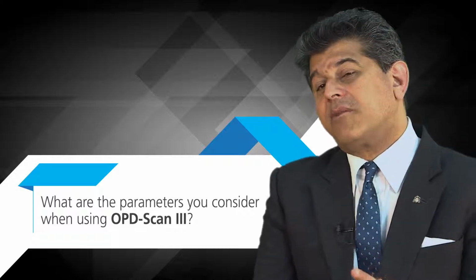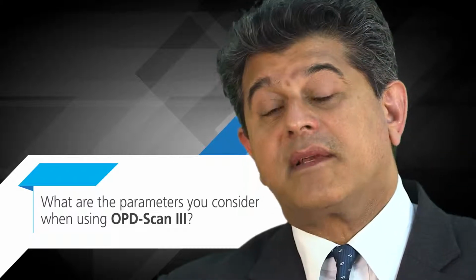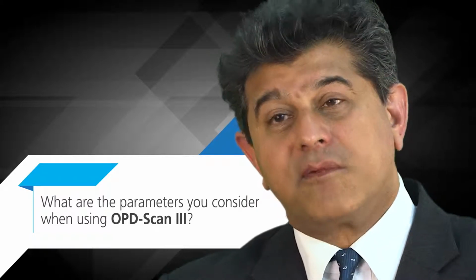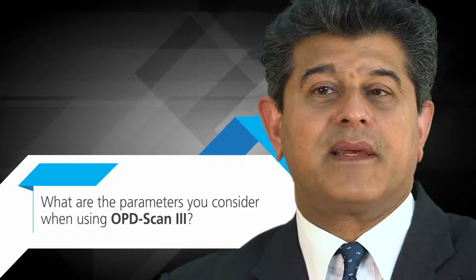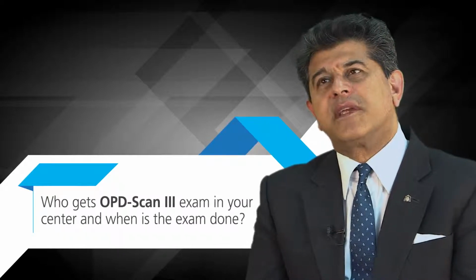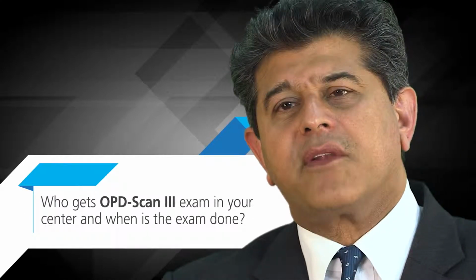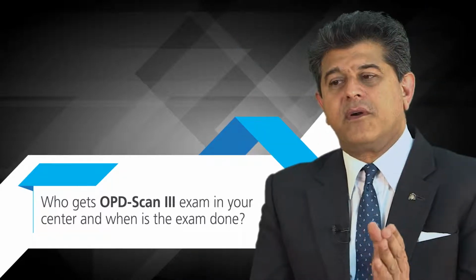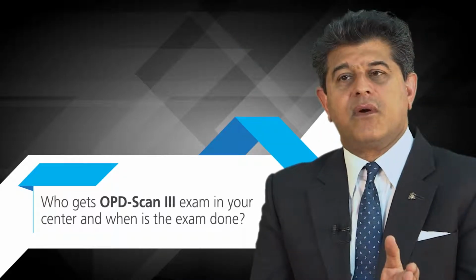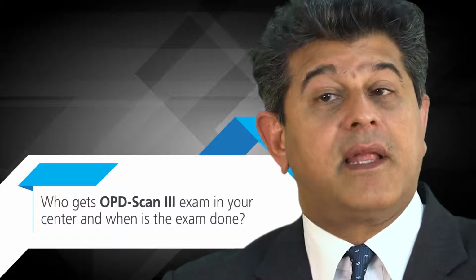So we came up with, working with NIDEC, we've devised a report. It's called the Refractive Lens Exchange Cataract Report, but as I say, it's very useful for laser eye surgery too. Where I find the OPD scan very useful, and I have to say my staff will do an OPD scan on every single refractive patient at every visit. And I find it very useful for things like toric lenses, or where to locate a limbal relaxing incision.